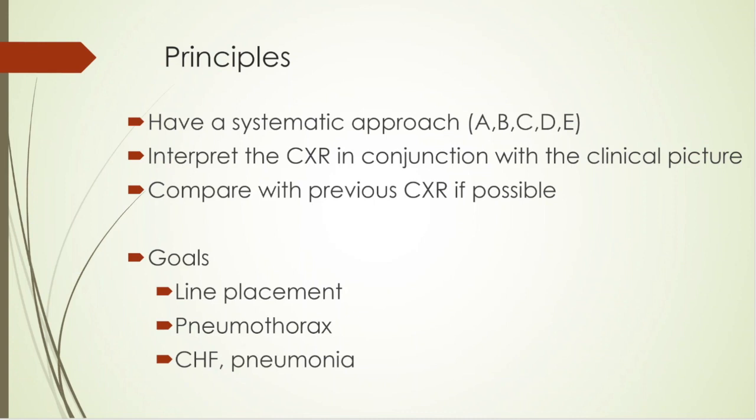You need to look at the clinical picture too. Just getting a chest x-ray alone without any clinical picture makes things difficult. It's so much easier if you have that clinical picture. So obviously if you're reading your own x-ray, you'll have that clinical picture, but if you send an x-ray off to a radiologist to be read, make sure you include a decent clinical picture that helps them out. If they have a previous chest x-ray, that's huge. You should be comparing it. It makes it really easy to pick out changes and just makes your life easier in general.